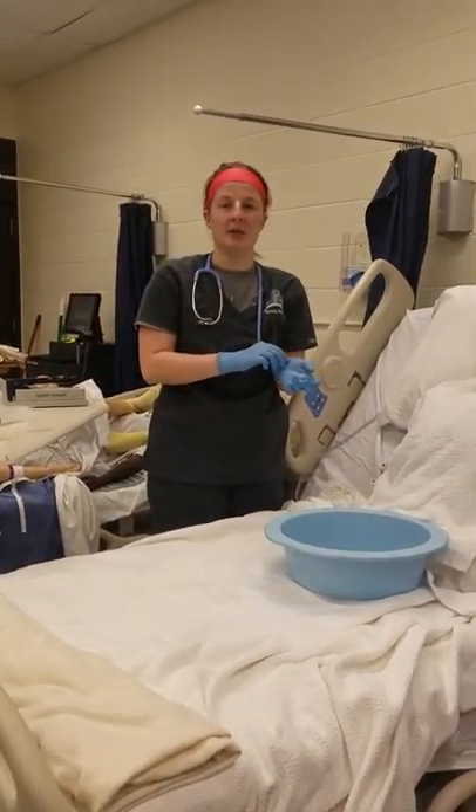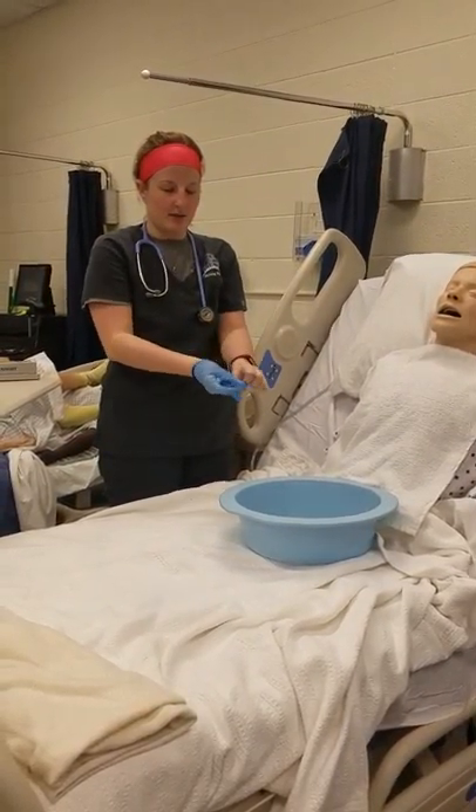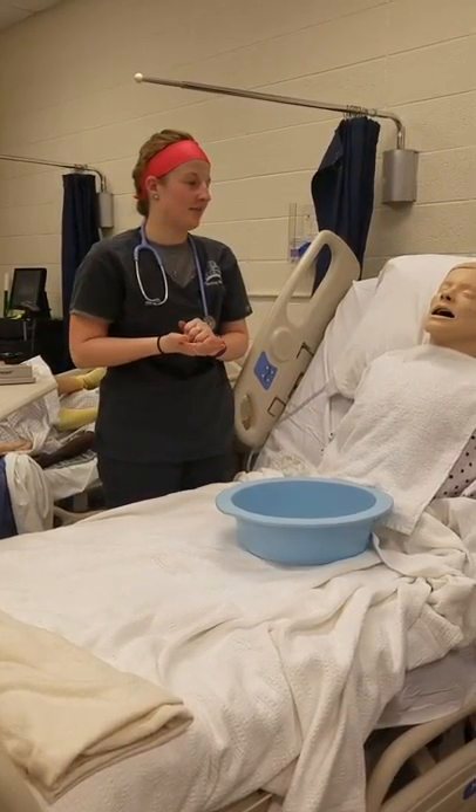Then I would go ahead and document how my patient handled the procedures both times. I would remove my gloves, perform hand hygiene, and that's all.